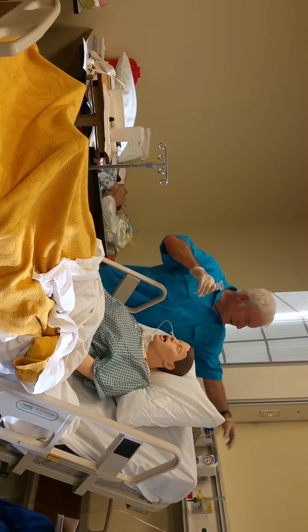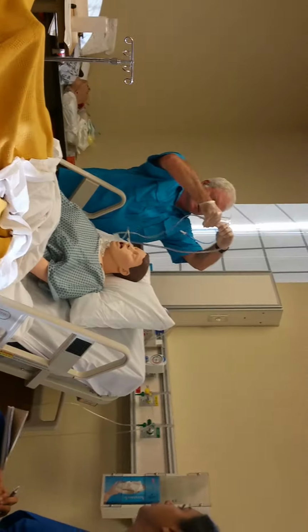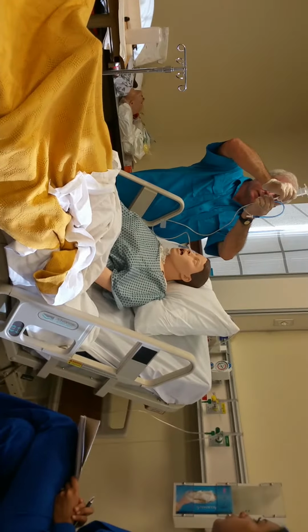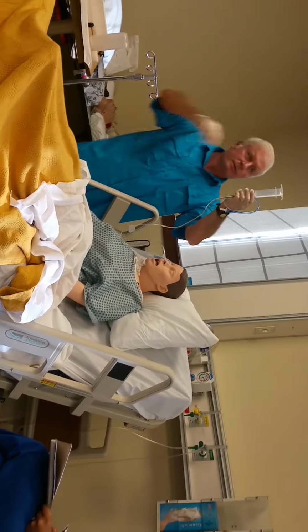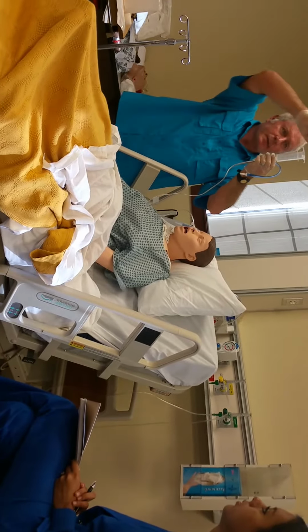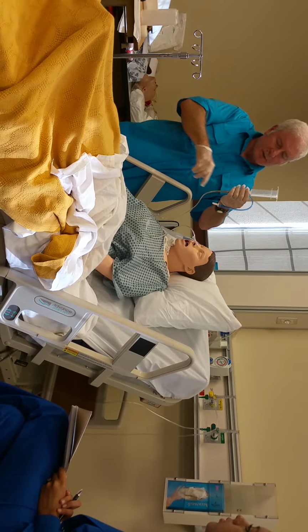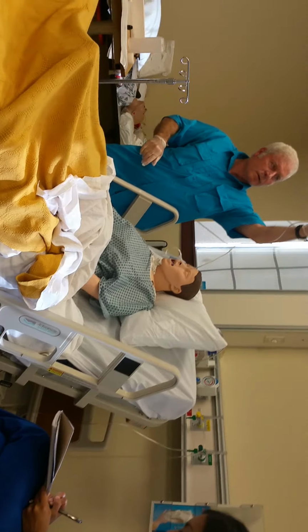If you give medicine, you can't do it while he's being suctioned, so you have to disconnect him from the suction. And the order will probably say withhold suction for 30 minutes or whatever. I've got my drinking cup. I'm just going to pour it in and watch it go in. If it's going in kind of slow, raise it up for gravity and it'll help it flow in better, okay?